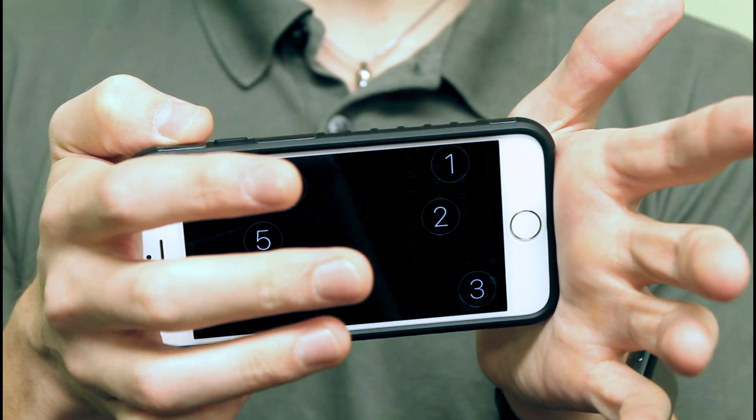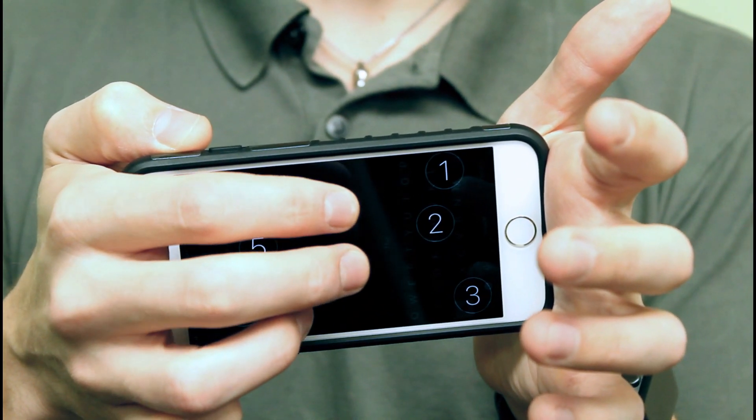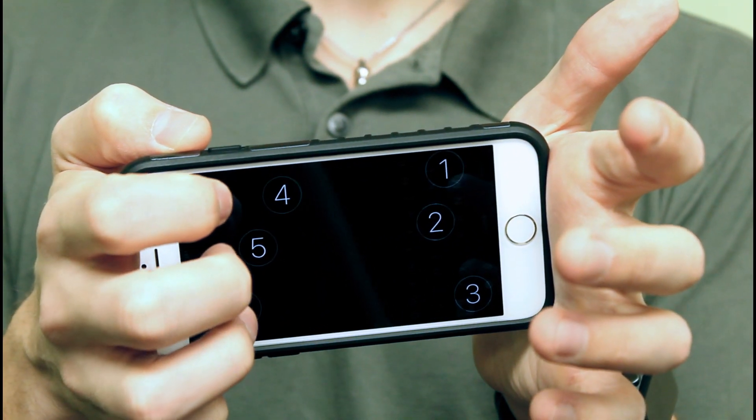Moving on to the two-finger gestures: two fingers swiped to the right will add a new line, and two fingers to the left will delete a whole word. That's a quick way to delete chunks of text — using that two-finger swipe left to delete by words, which is very helpful.